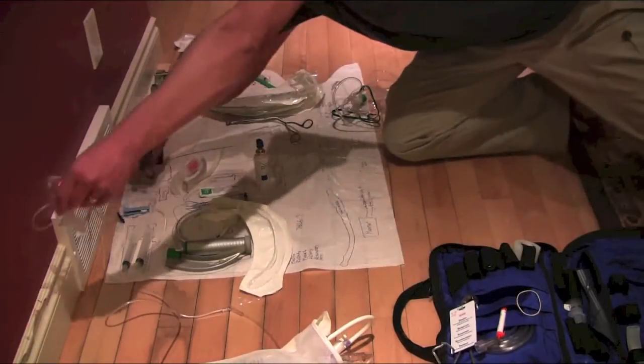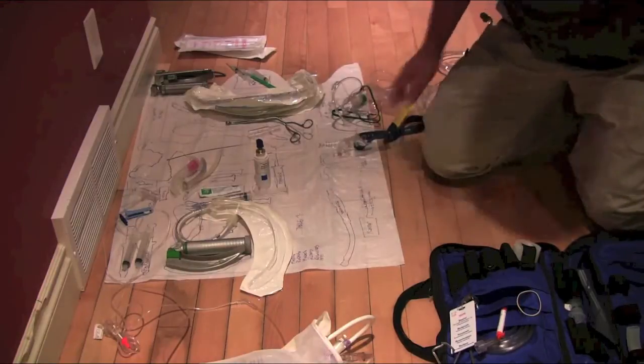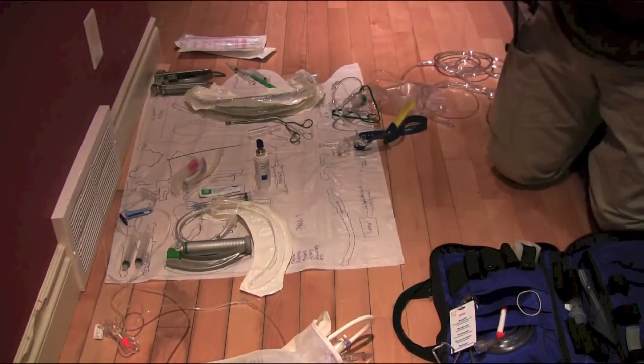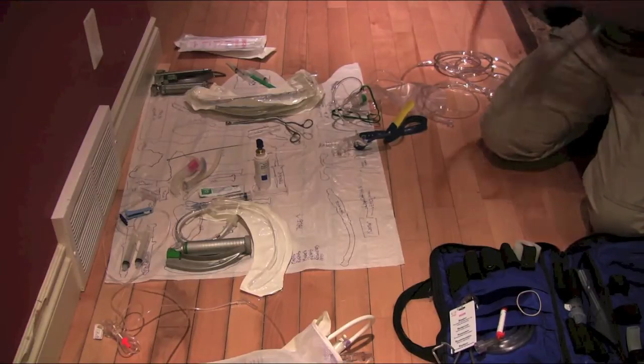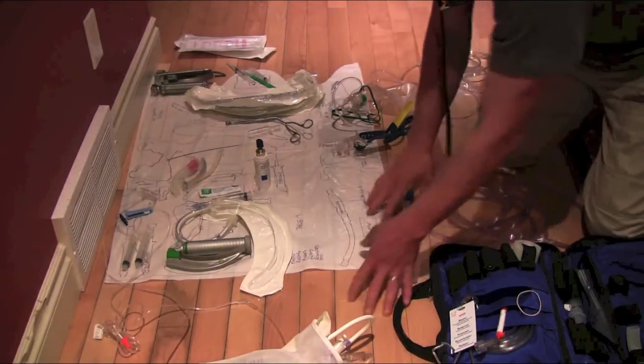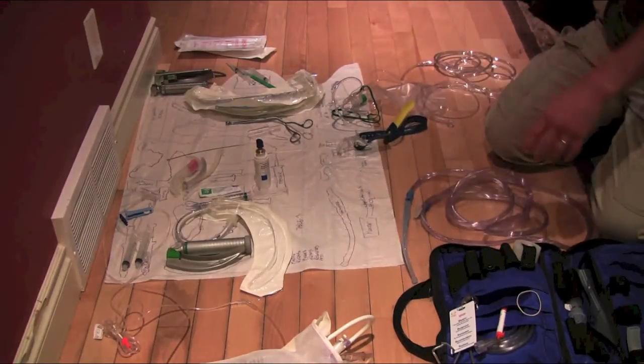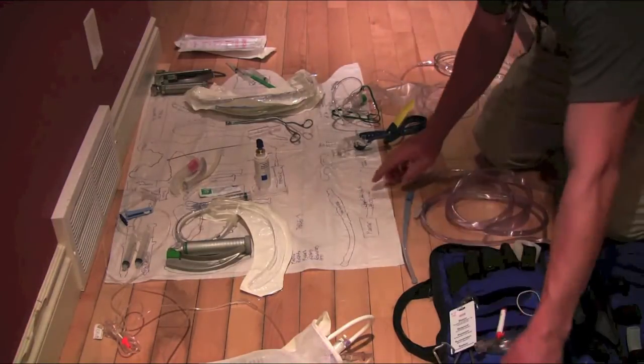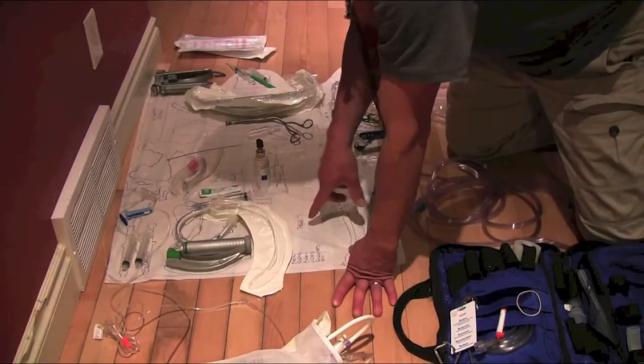Get that attached to the monitor. Put this underneath the patient. Stethoscope, get that ready. Get the Yankauer suction ready at the bedside. Provide the patient. Patient's attached to the monitors. Make sure that the cuff arm is opposite to the IV arm. Nasal end-tidal CO2 applied as required. Let's check that we've got everything here.